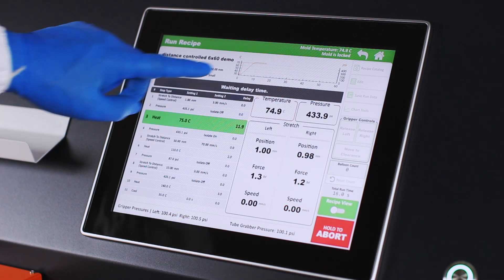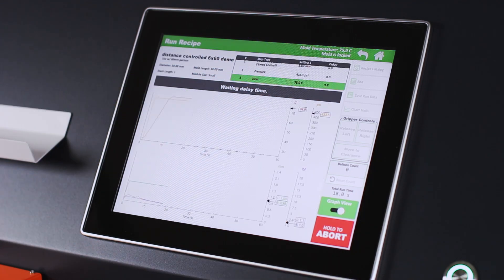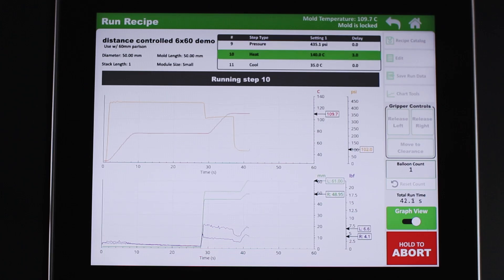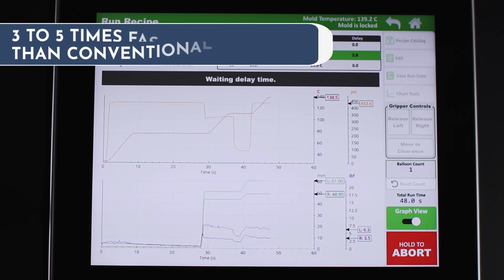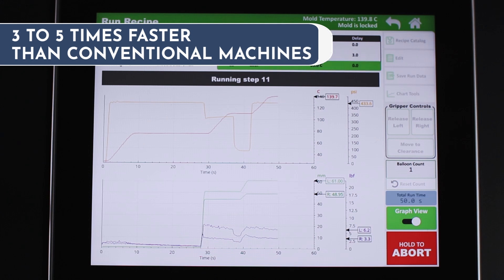Due to the induction heating system, molds can be heated to and cooled down from forming and heat set temperatures in a matter of seconds. The Blockwise Balloon Former will run most balloon processes three to five times faster than conventional machines.